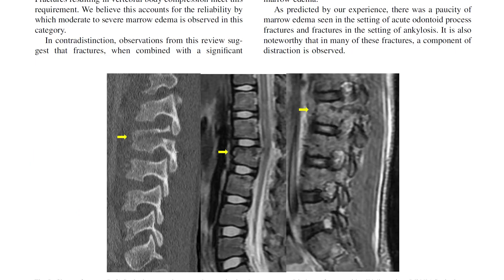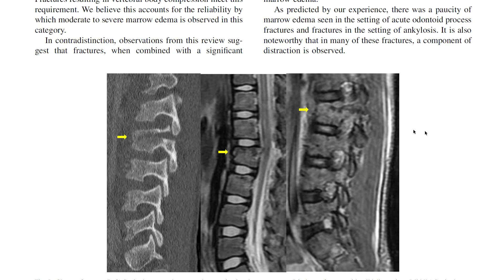Here you can see a chance fracture going through the vertebral body — a classic finding on CT — but on MRI there is not really a lot of bone marrow edema going on. This is very, very interesting.